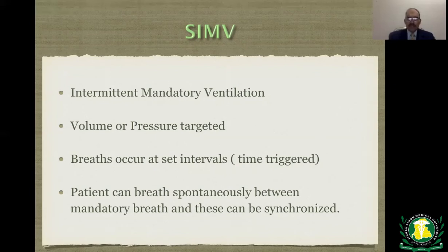Breaths occur at set intervals. For example, if you set the patient at a rate of 12 breaths per minute, that means every 5 seconds there will be a breath. The patient can breathe spontaneously between mandatory breaths, and these can be synchronized.